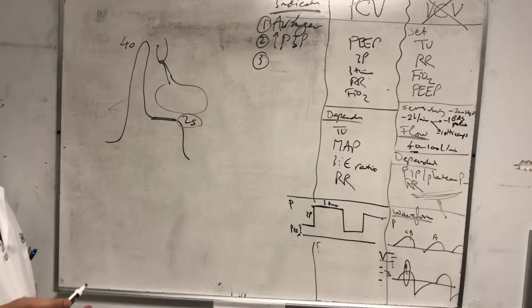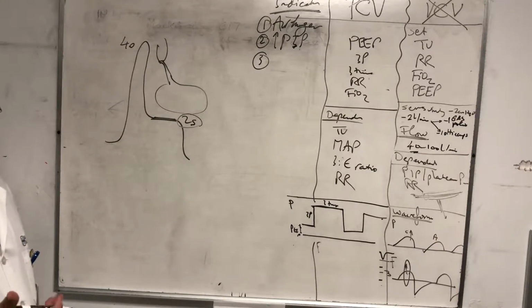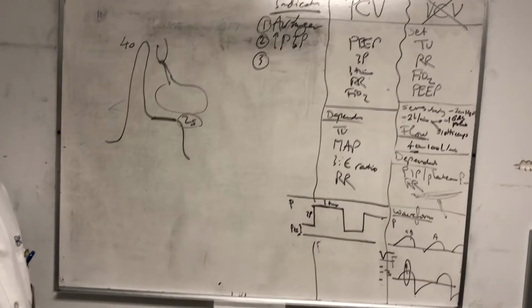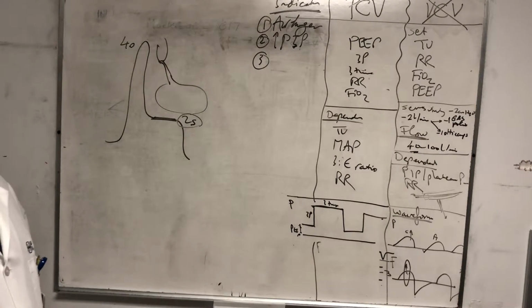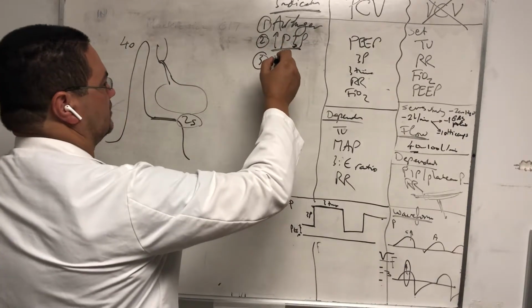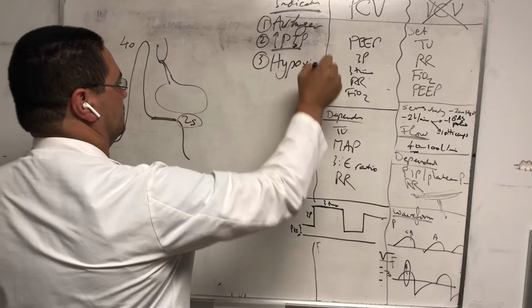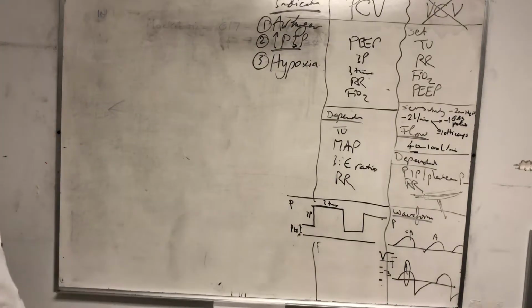But until what pressure? What pressure will you give before you say, now I'm scared, I can't give any more? Like 70? Are you gonna accept 60, 70, 80 of pressure? Of course we're not gonna accept that. So everybody has his own number. I have 45. If it's 45, I'm putting him on pressure control. Put him in a mode that will limit the pressure, but at the same time will give me a good tidal volume because of the inspiratory time. So that's another indication. And then the third indication is hypoxia. We'll spend about maybe 15 minutes talking about why hypoxia is better with pressure control than in volume control.